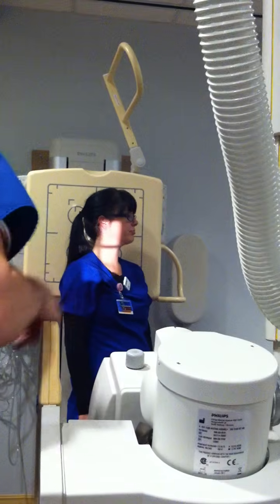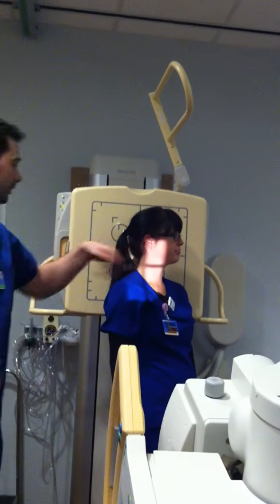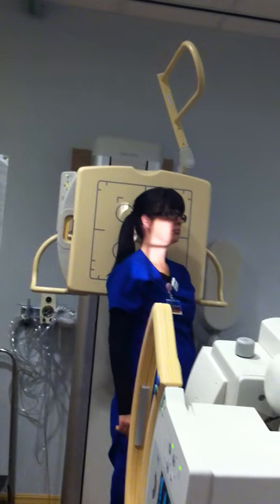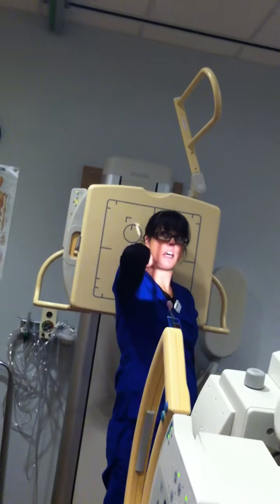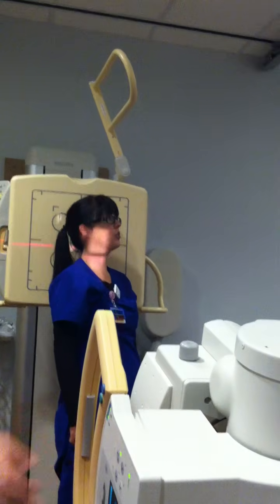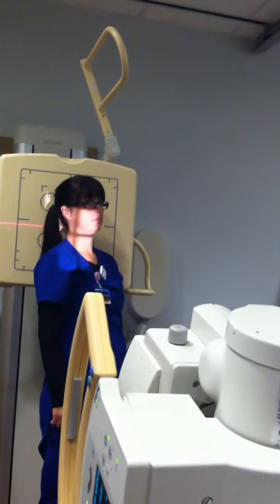Now, what are maybe some other considerations? She has her glasses on, necklace on, all the stuff. Yep. And really on this one, watch for bra or undershirt straps that have those little clips on them. Her earring is hiding in the middle of her ear. A ponytail would show up? Not in this one, but your ponytail would show up on our open mouth and Fuchs, maybe even the AP. Maybe making sure that she's looking straight ahead and that she doesn't watch you go back into the room. So we have to remind her once you get her head in position.